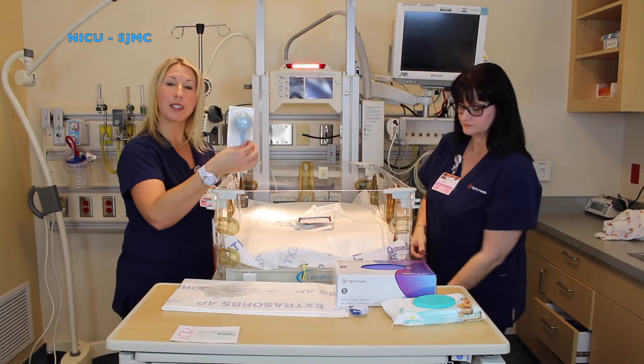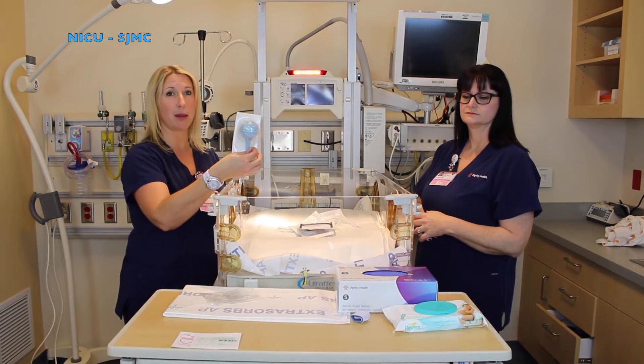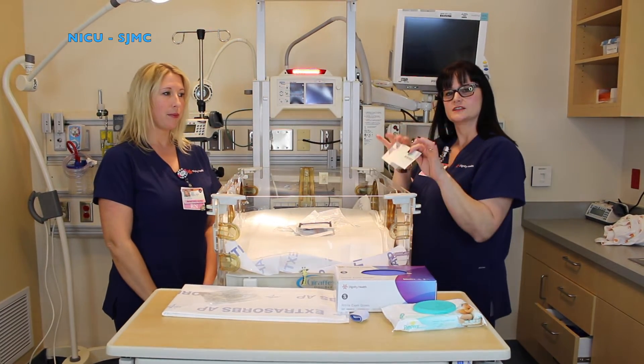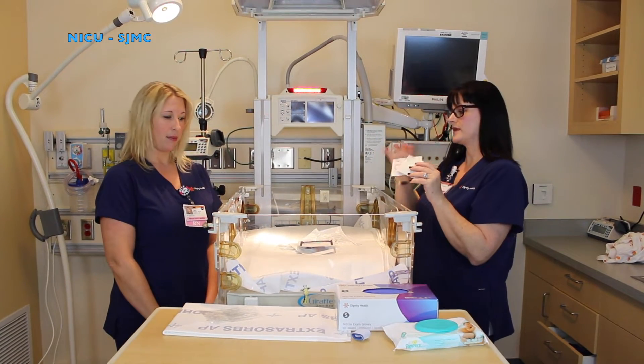You will also need a full suction set up in case your baby needs immediate intervention if there's something in their mouth or nose. You're also going to need something to secure your skin temperature probe. You have a small size heart for your smaller baby and a larger heart for your term baby.